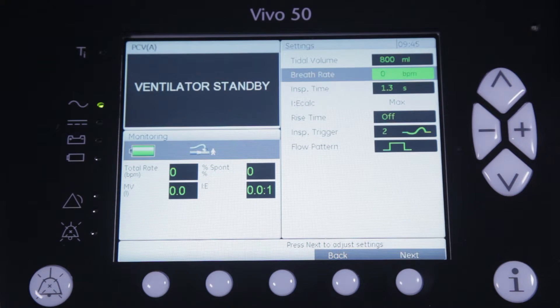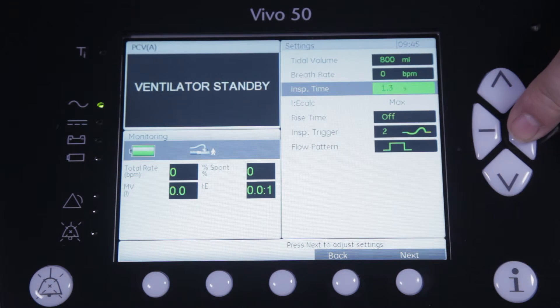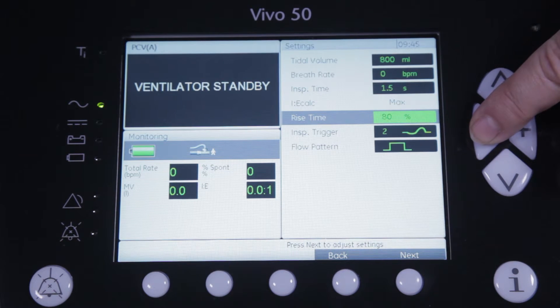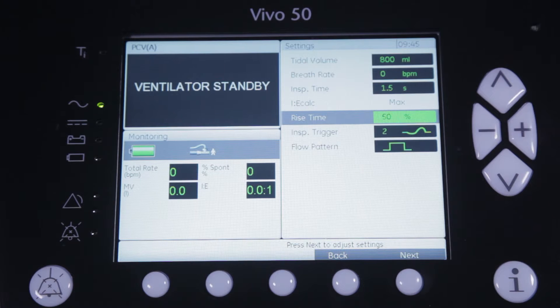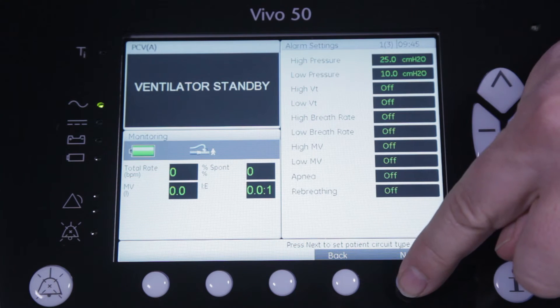Furthermore you will select the inspiratory time, and eventually select a rise time to increase the peak flow when the air is delivered to the patient. A level of inspiratory trigger will allow the patient to trigger a breath in a comfortable way. When you press next you will automatically be guided to the alarm menu.